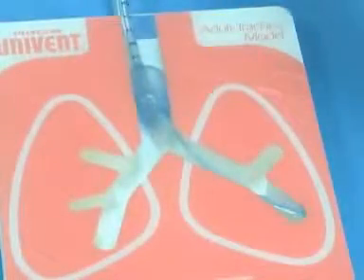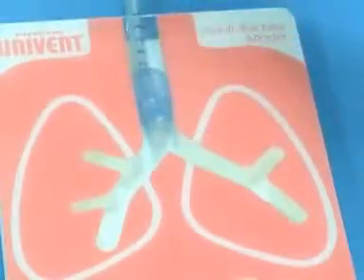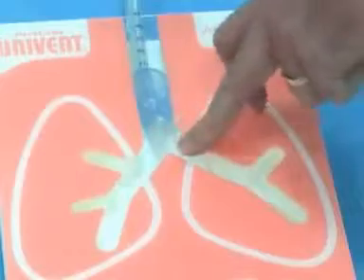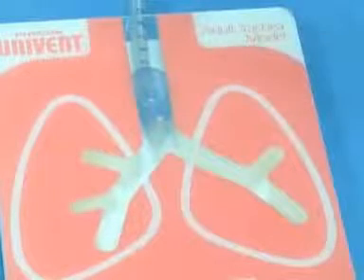The Arndt bronchial blocker uses the same basic idea — a regular endotracheal tube with a blocker slid down the middle. The concept is identical: you see the carina and see the balloon on one side or the other blocking it off. That covers your lung isolation techniques.